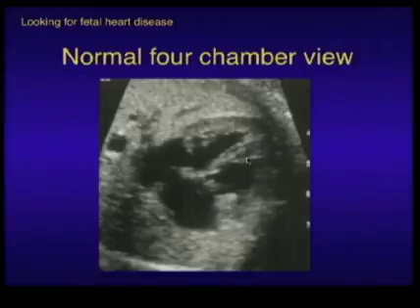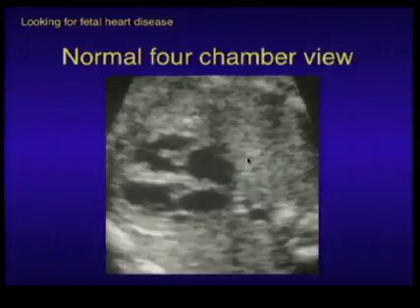This is cut off, so it's hard to see that this only occupies a third of the chest, but we'll be able to see that better in some subsequent images. Here's a long axis four-chamber view, so-called because the septum is sitting horizontally on the screen. Here we've got a better sense of the whole circumference of the chest, and I think it's pretty clear that you could put at least 2 more hearts inside this chest.